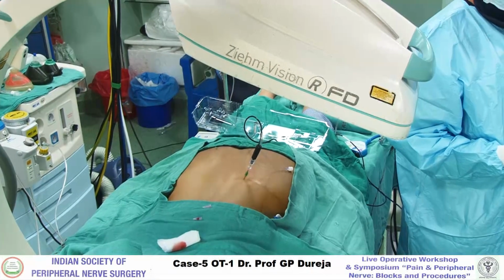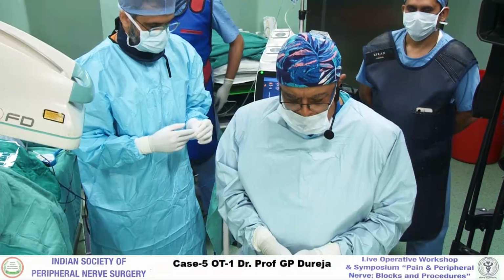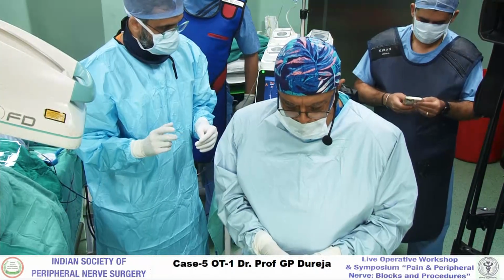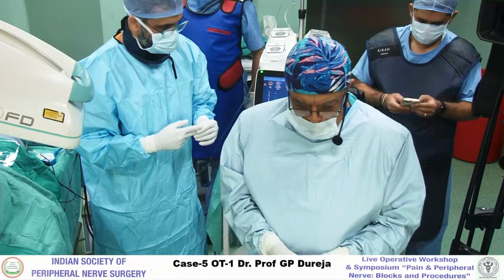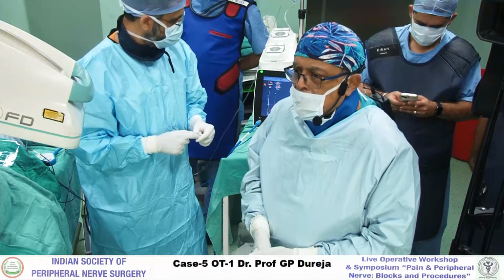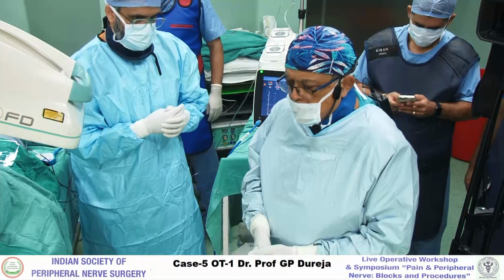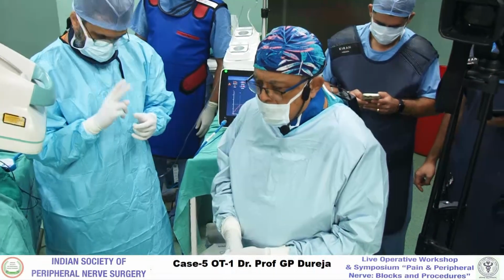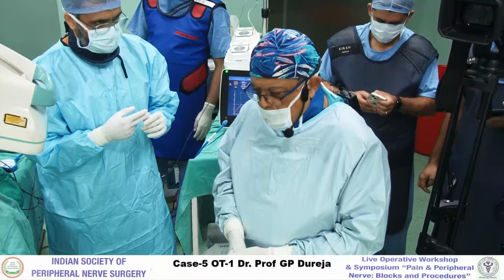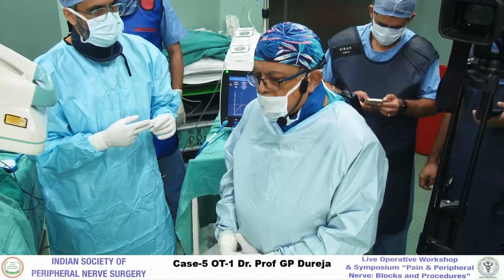Any questions? So the question is for L4 joint we are taking the L3 route. Yeah. So if we had to go for higher joints we would take one route higher. That is the question. So actually sir, for a one facet joint, let us say for L4, L5, we are doing two entry points. Yes. One for L4 medial branch and one for L3. Yeah, that is because there is a twig coming from L3 to L4-5. The two levels are involved. That is why we are taking two levels.